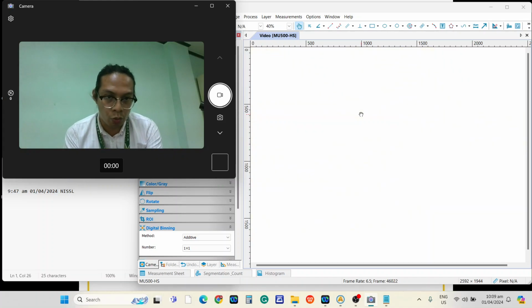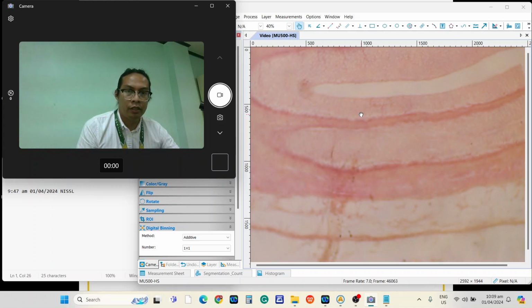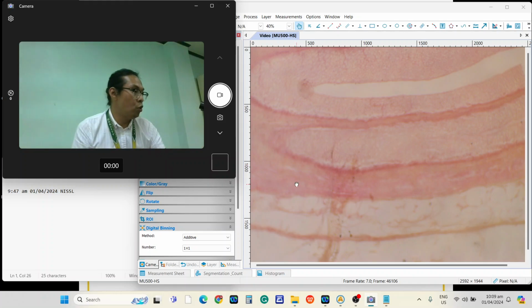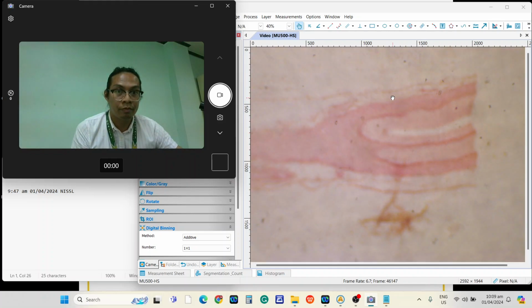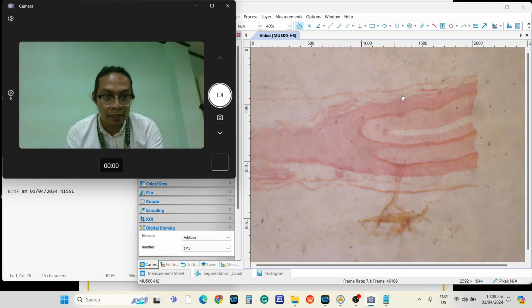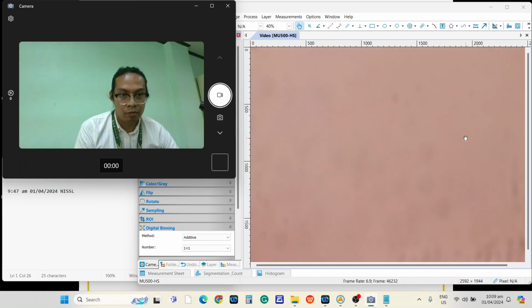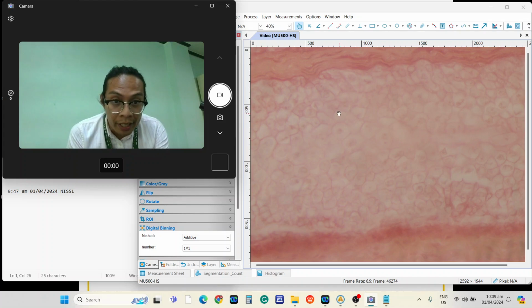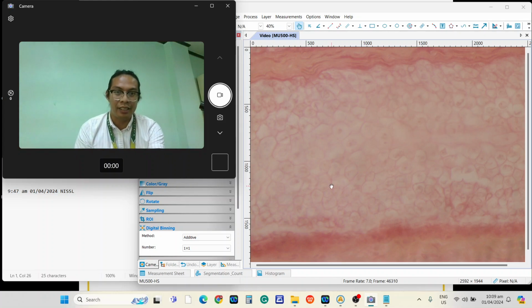While this one, yung isang nerve bundle, this is a nerve bundle that is the perineurium. And the whole covering of it all, that is the epineurium. Okay, epineurium, perineurium, and the endoneurium. Yung lattice, yung mukhang lacuna na nakikita natin, so that is the endoneurium.